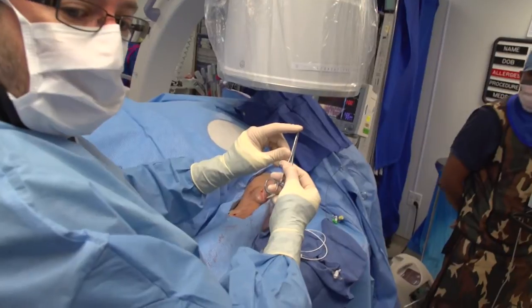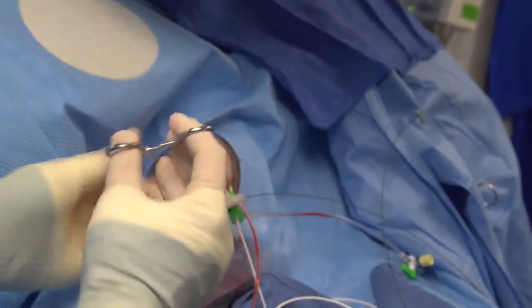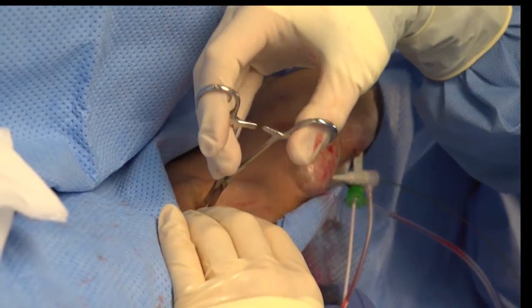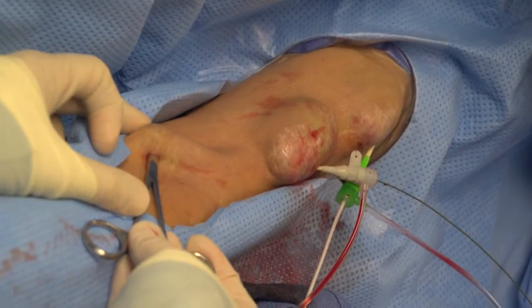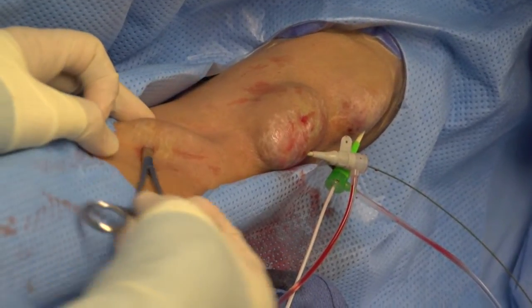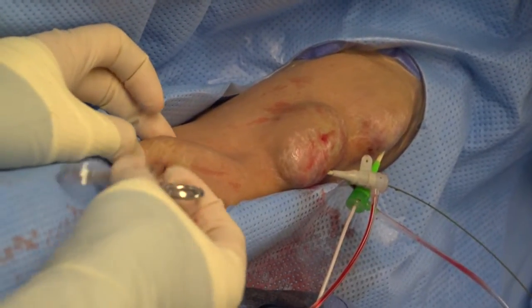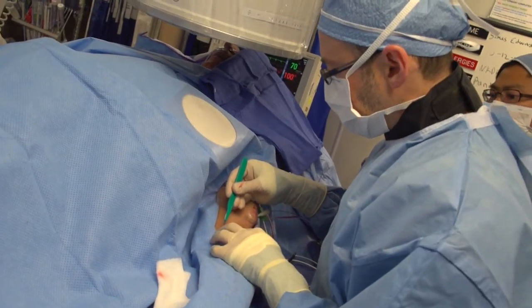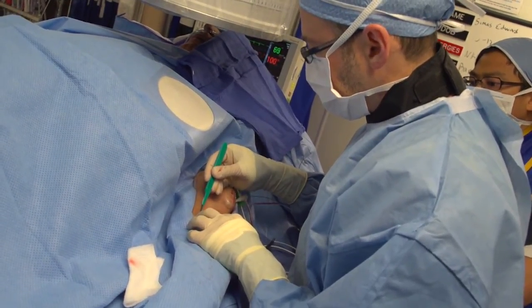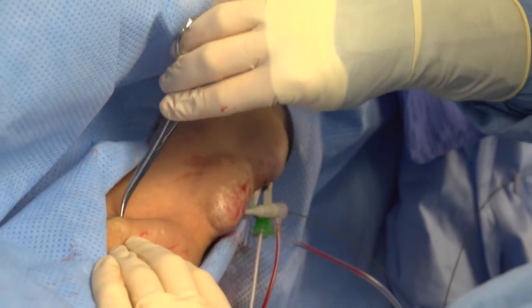We start by making an incision in the juxta-anastomotic segment of the fistula, about half a centimeter in length. The Kelly clamp is then used — you can see the tip is relatively dull. The first thing we do is build a pocket, then tunnel underneath using standard blunt dissection techniques. Once the Kelly clamp has made its way to the other side of the fistula body, we palpate where the tip is poking through the skin and make a second incision at that location.